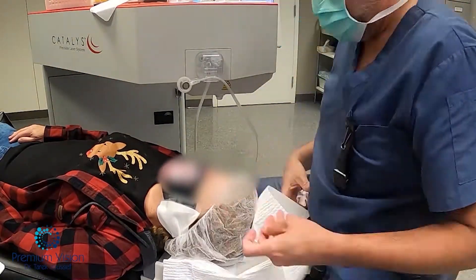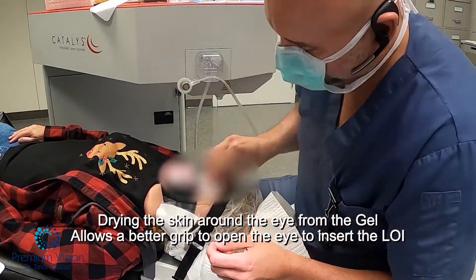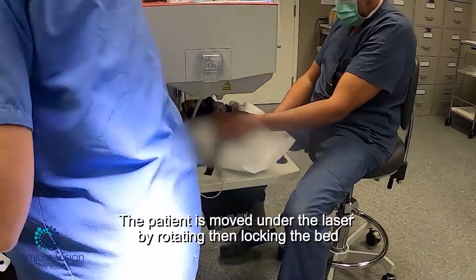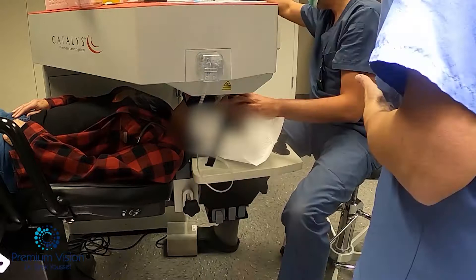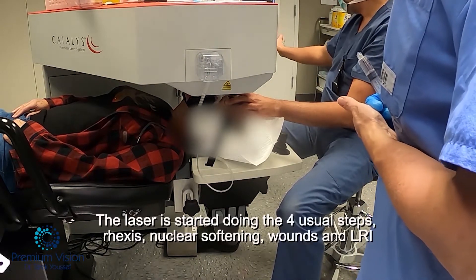I just started to prepare the laser machine, stabilizing the head with the strap, drying the skin, applying the LOI — the liquid optic interface — and then moving the bed underneath the laser and raising the bed to couple with the lens that's attached to the laser.